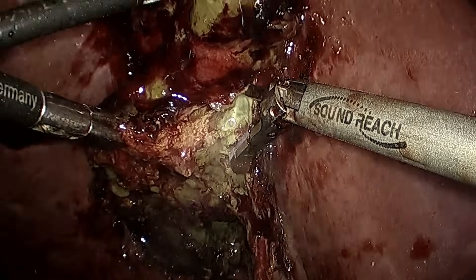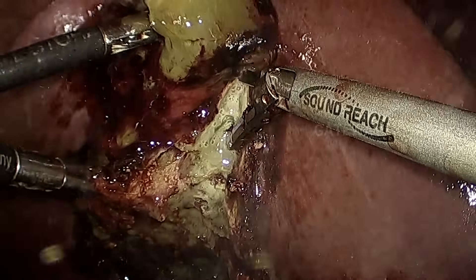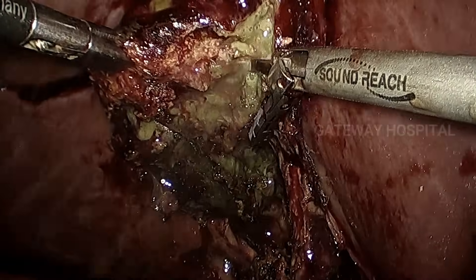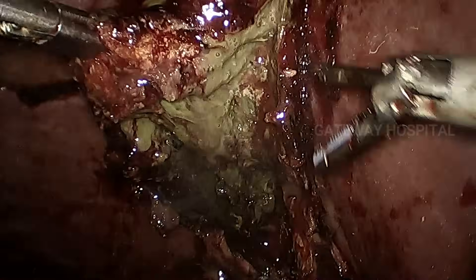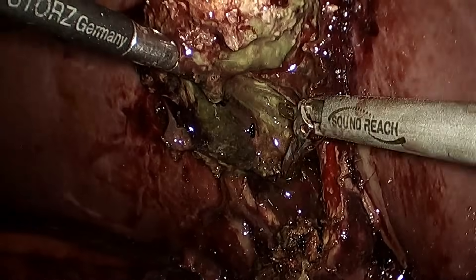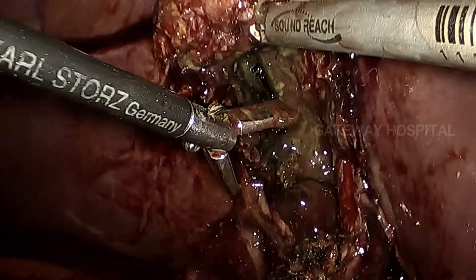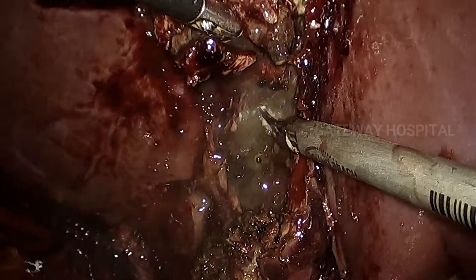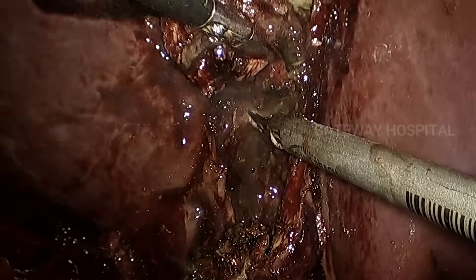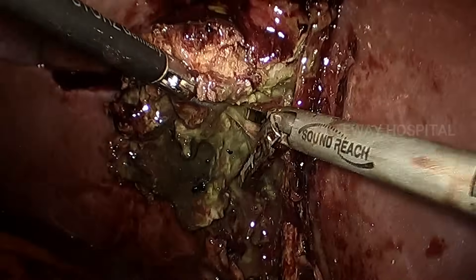We are using it like a spatula — open the instrument and use the vibrating blade to separate the gallbladder from the liver. The posterior wall, which is adherent to the liver, is sloughed off and carefully dissected away. Sometimes there will be an abscess between the gallbladder and the liver bed, so if there is any abscess it should be drained and the cavity should be thoroughly washed.